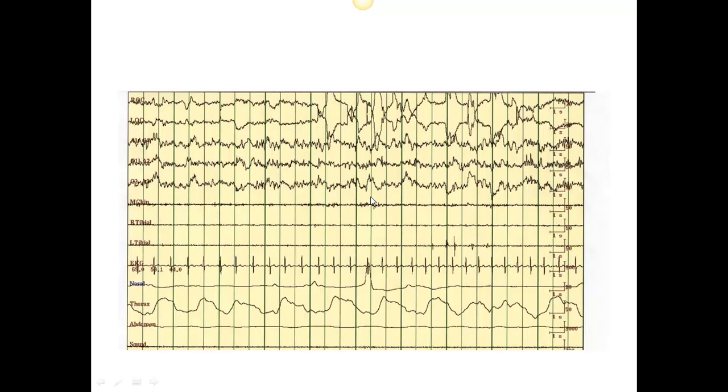Here is an example of stage R or REM sleep. What we see here is a reduction in the amplitude in the chin, a slowing of the frequency of the background EEG, and rapid quick eye movements. We don't always have to have eye movements to score an epoch of REM, but this makes it real obvious.